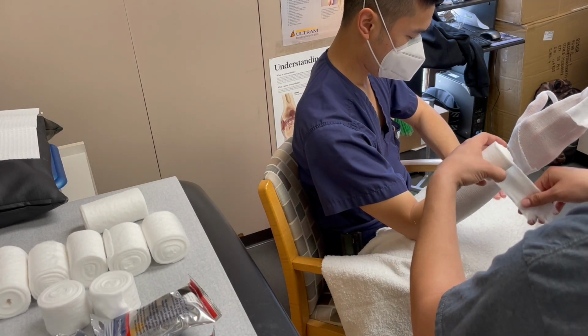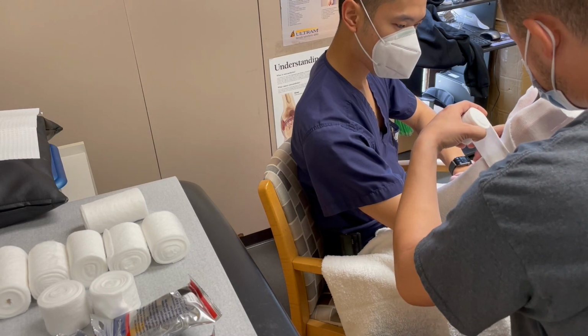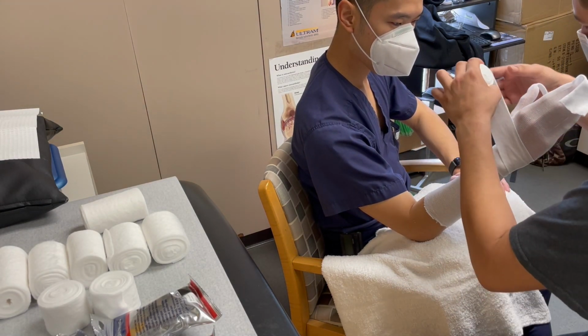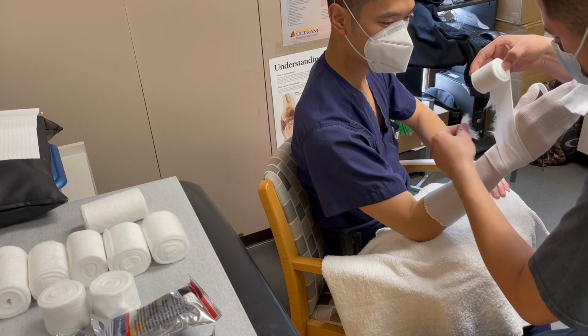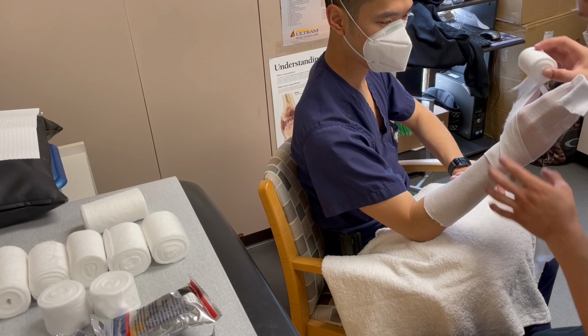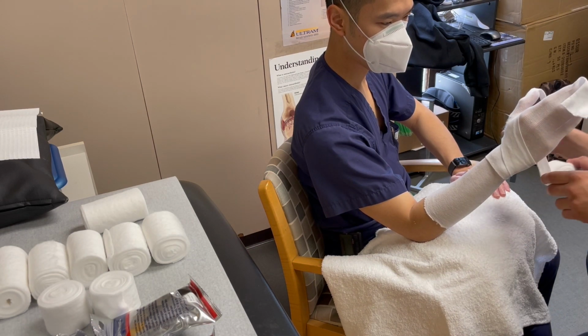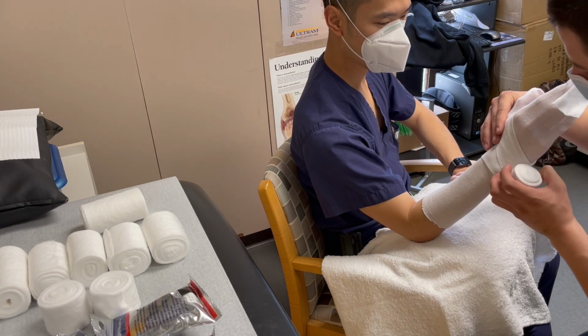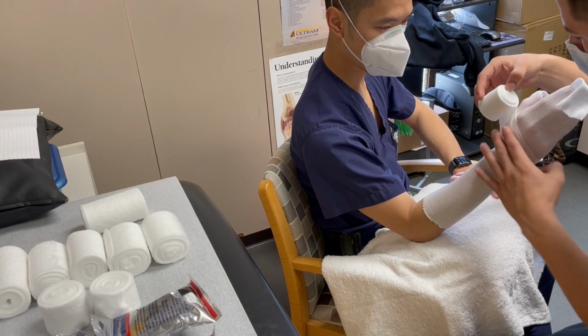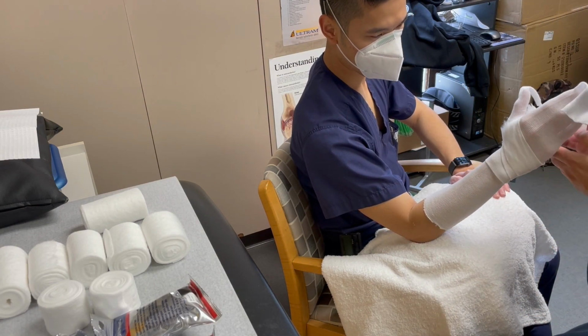We start off with 2-inch padding and wrap it around the wrist. Go ahead and make a little tear here at the bottom of the padding in order to lay it down in the web space in between the thumb and index finger. As you notice, every time we have the padding down in between the web space, we'll make that little tear.